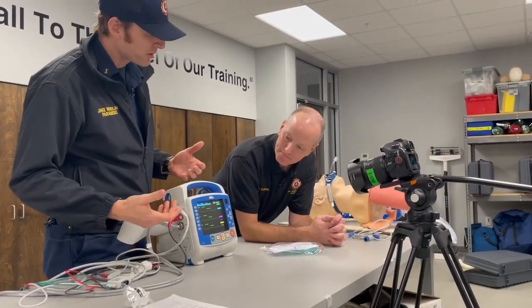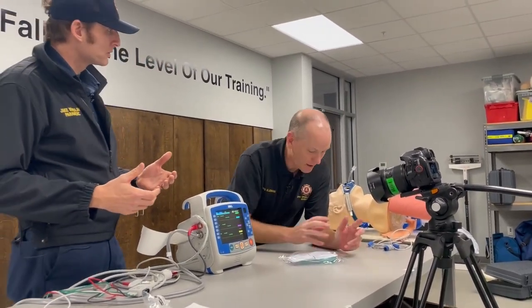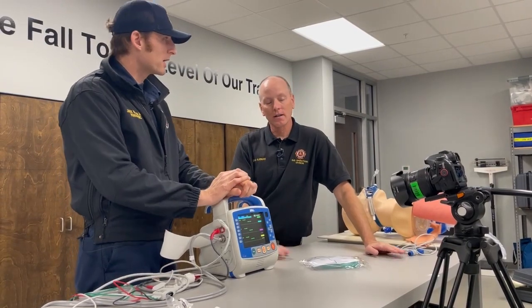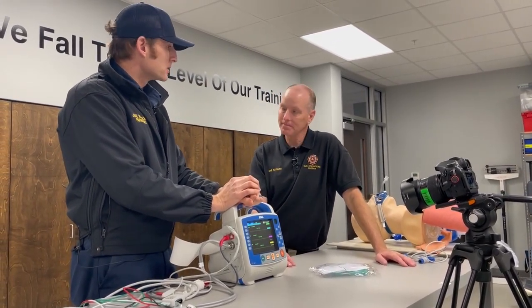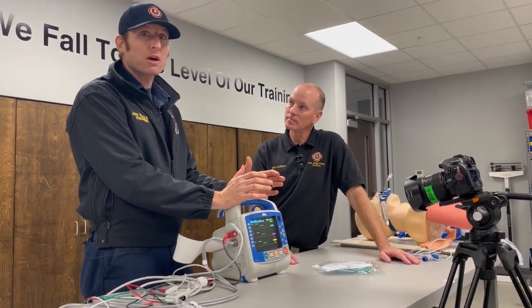All right, David, so the next thing we're going over is end tidal capnography. I am a big proponent of end tidal. So I love end tidal. I really think it's probably one of the most underutilized tools that we have. I totally agree.